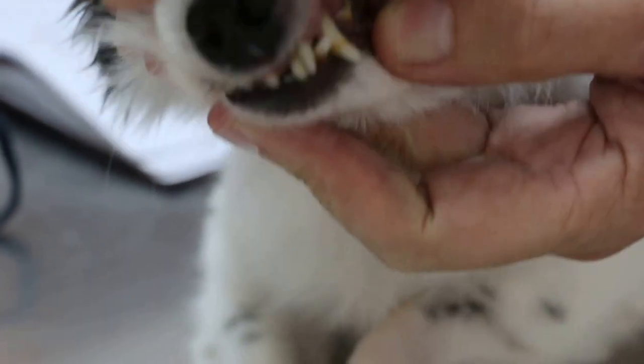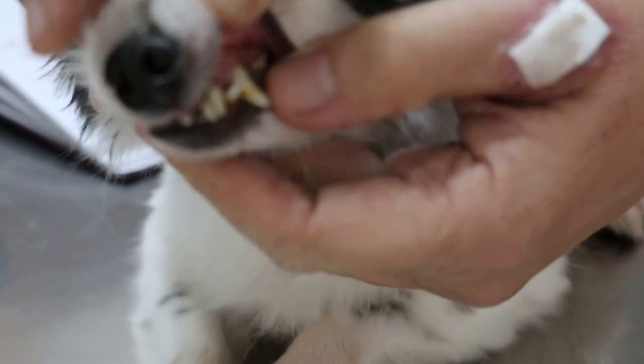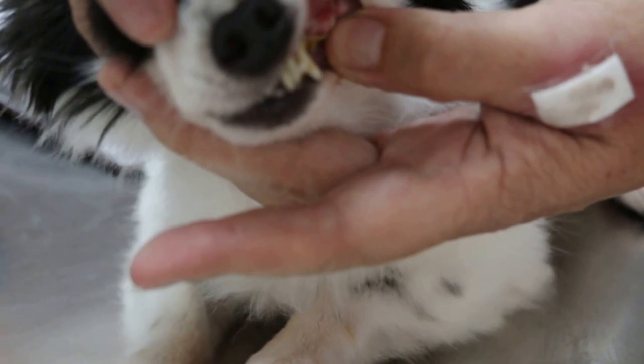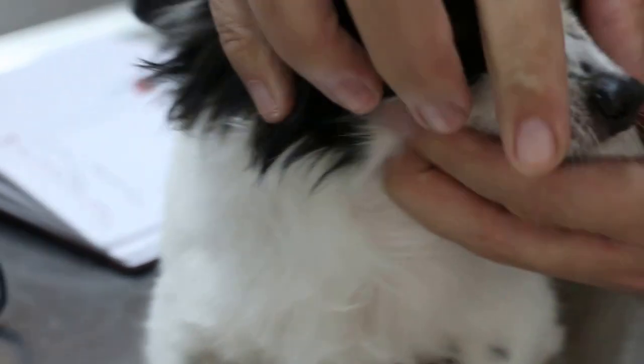So the teeth overall is in good condition for the age. But you can see the root has been exposed for the canine teeth. And then the back teeth, you can see tartar and gum inflammation, gingivitis. But not so bad.